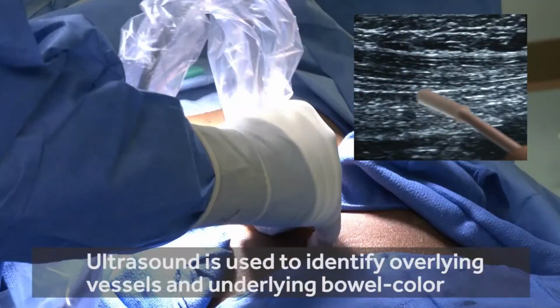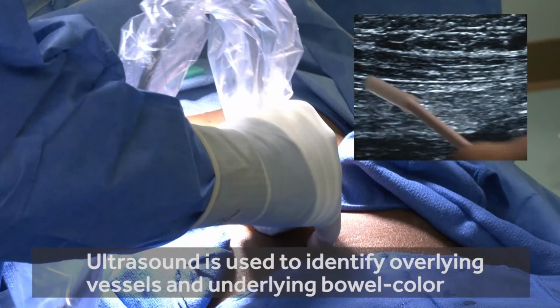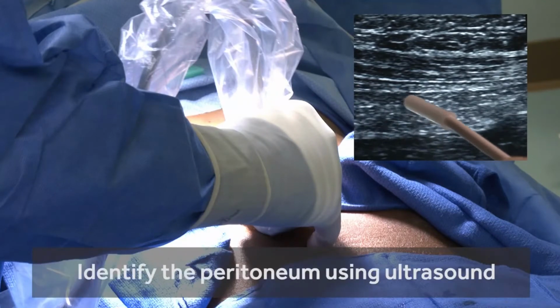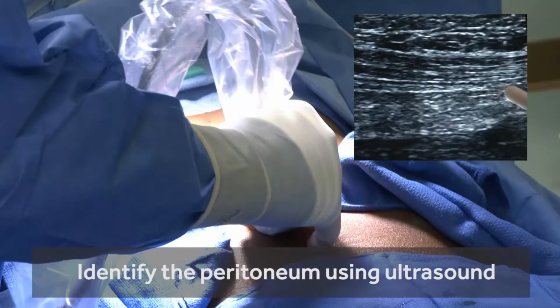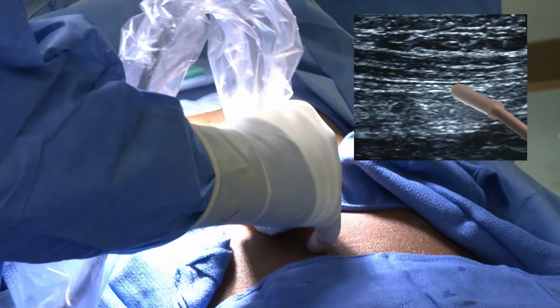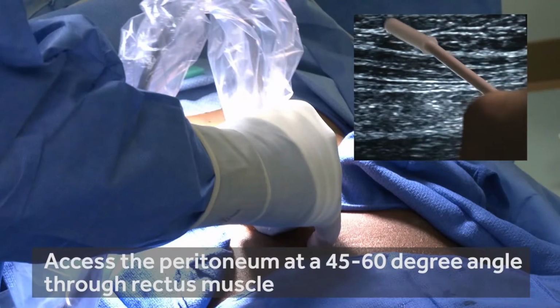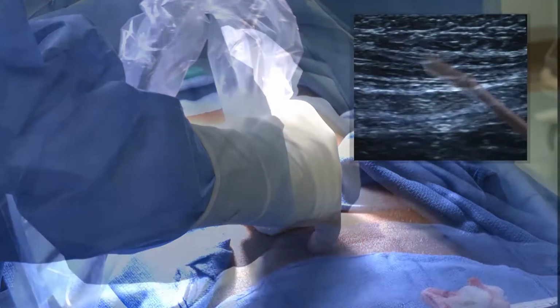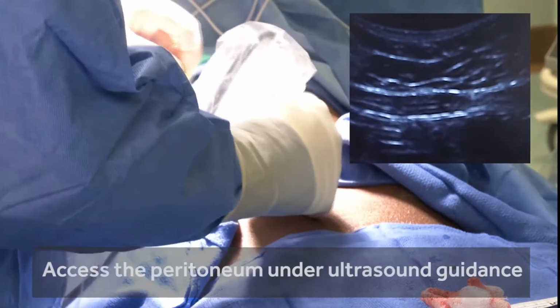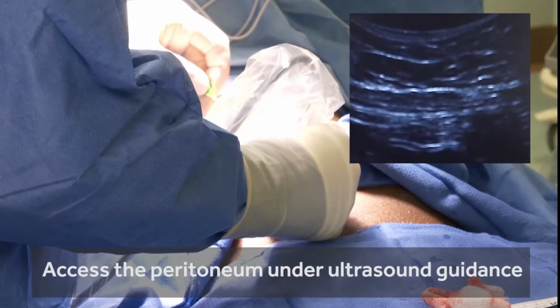Now I use ultrasound, and you can see the anterior abdominal wall, and you can see the peritoneum sliding back and forth. I use ultrasound to guide the needle down to that point just above the peritoneum. And then we're going to have a 45-degree angle of the needle, ideally. And now with ultrasound guiding the needle down to the peritoneum, you can see it right there above it.